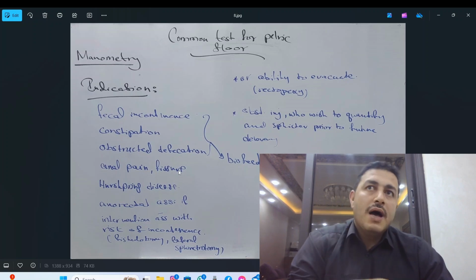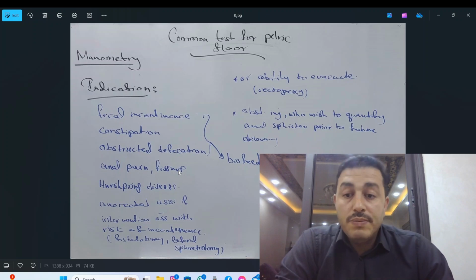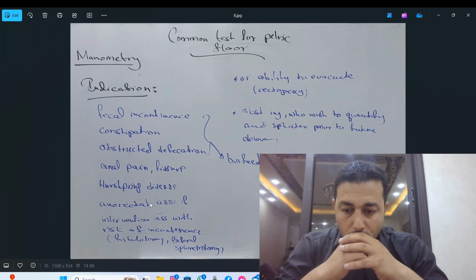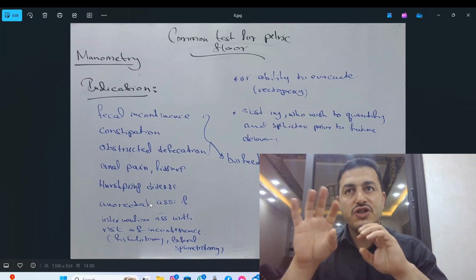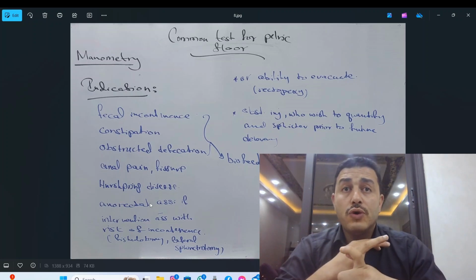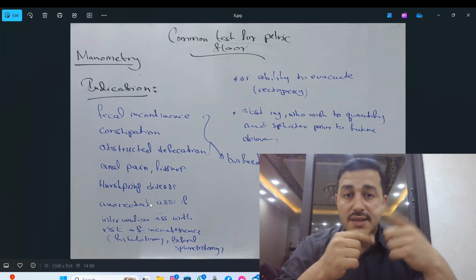We will see how to evaluate the reading of anal manometry, and we will see that a fissure will increase the tone of the anus, and Hirschsprung disease also. And if we are planning for any surgical intervention in the anorectal region that may affect continence, for example, if we are going to do fistulotomy, we may need to cut some muscles.